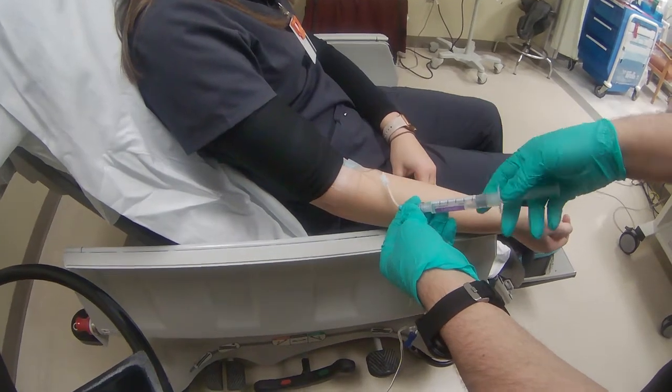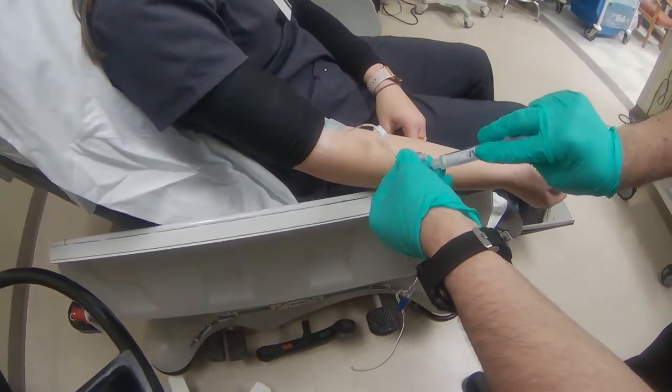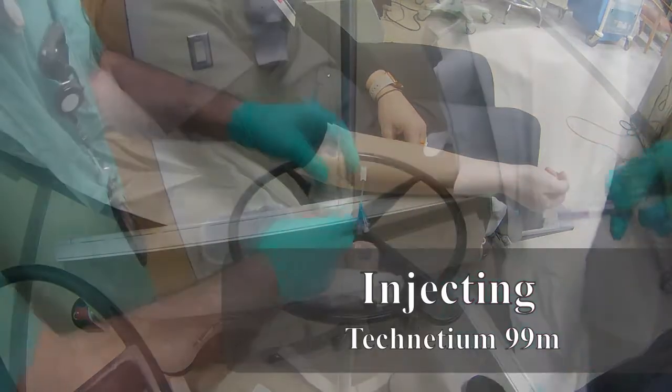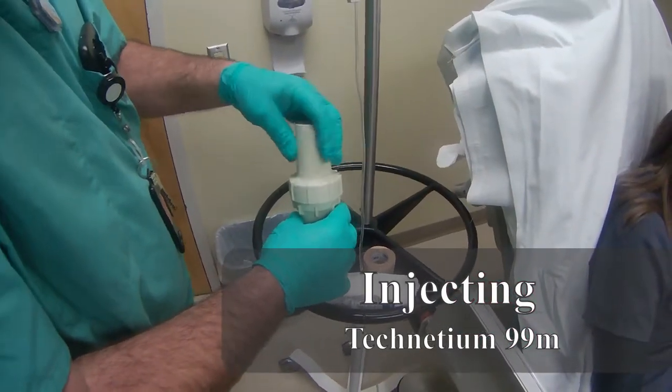Make sure that this is open and I inject this over 10 seconds. After you have injected the regadenosone, your technologist will be preparing the technisium.